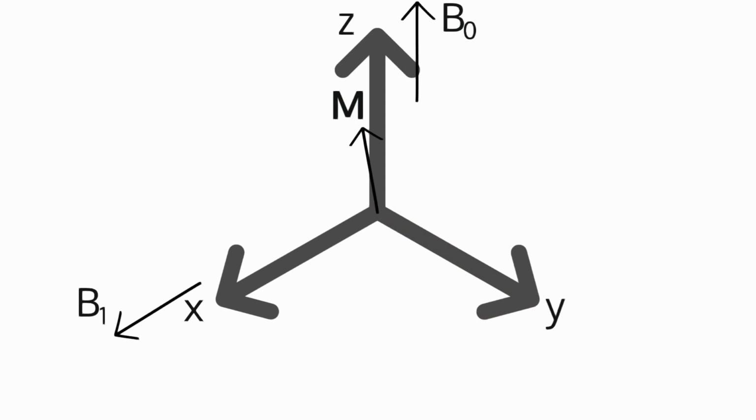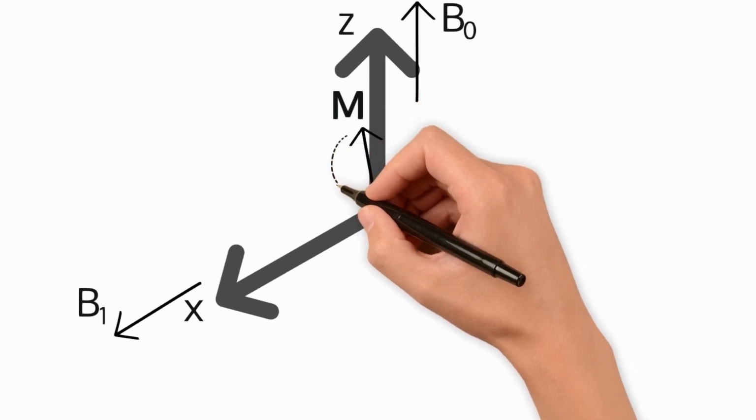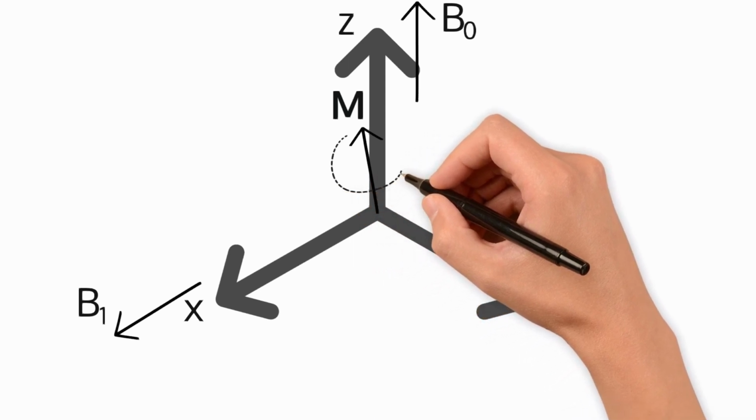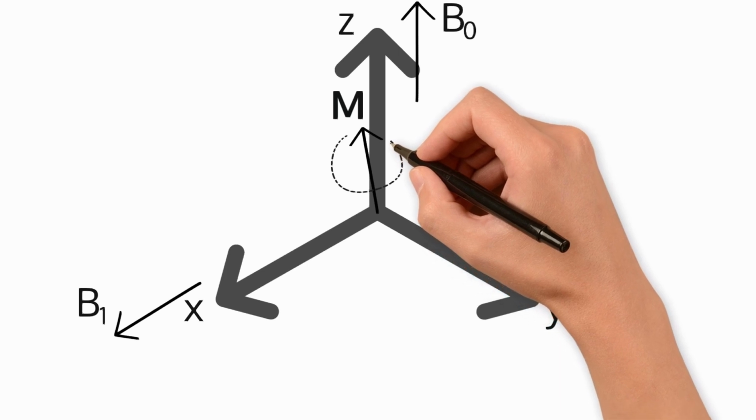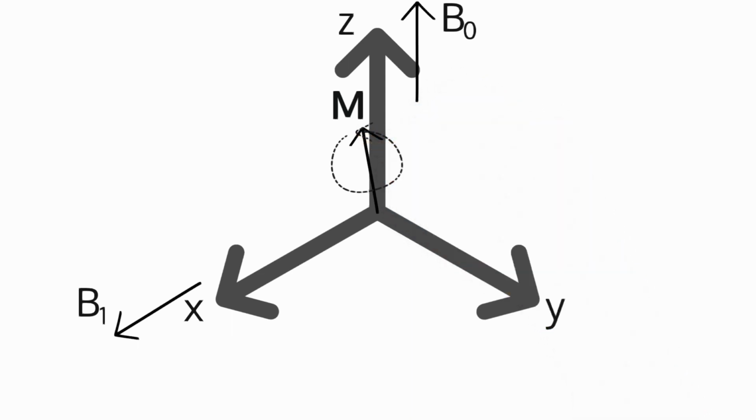As soon as it moves, however, it will no longer be parallel with B0, and thus precess around the z-axis as well, at a rate faster than around the x-axis. This means that before M has gotten very far from the z-axis, it will already have completed a quarter of its cycle around the z-axis, after which its precession around the x-axis will move it towards the z-axis. The total motion of M will be a repeated wobble around the z-axis in the positive x direction. This isn't particularly helpful or noticeable, so let's try something else to get M moving in a useful way.